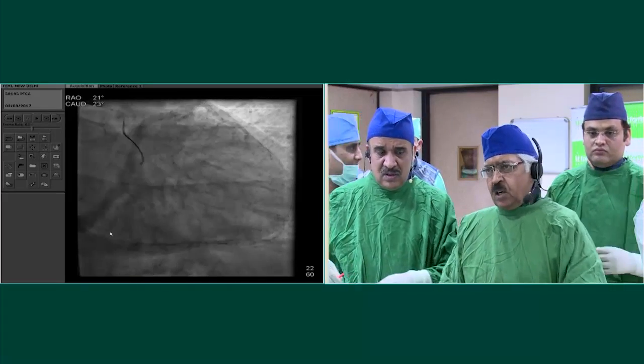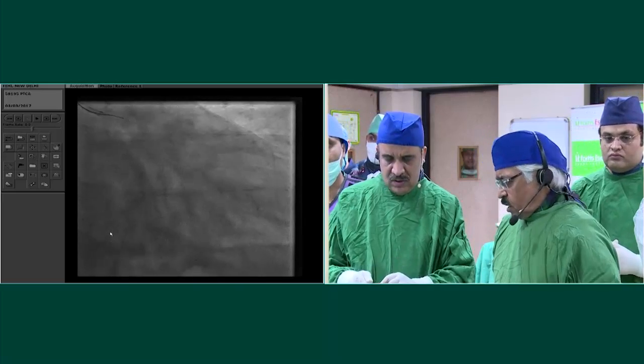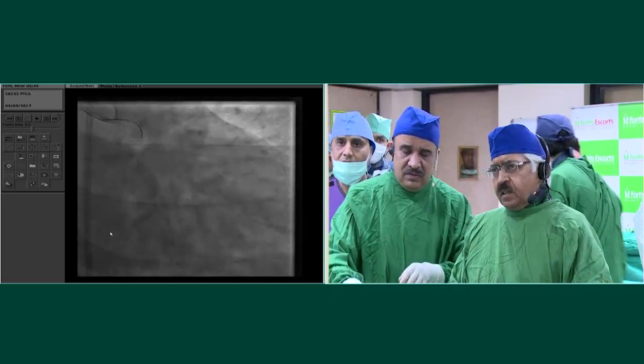But what do you think, Jean? I mean, this is a young guy. Let's think that we are pacifying his very soft plaque. This guy could progress his atherosclerosis fairly rapidly. All of us are puzzled by this circumflex, isn't it? 10 millimeter gradient.